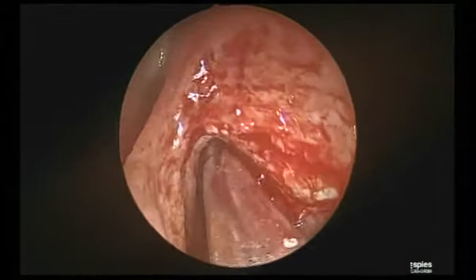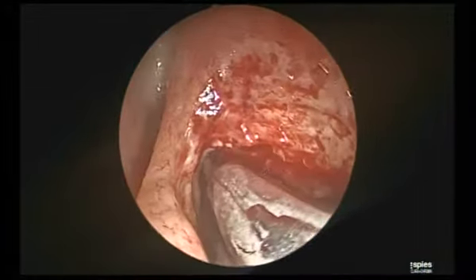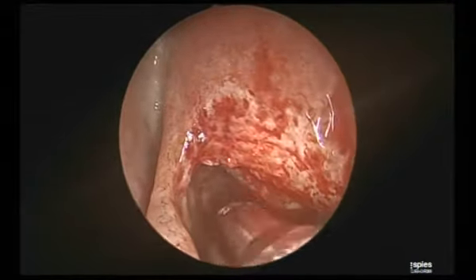Why is it not working? What? Isn't it new? Brother, what did you give? No, this is partially clogged. Looks like partially clogged. Is there ever any cell attached to the beak, or is the beak just dense bone? There are some interethmoidal cells in this region. So you need to flush.